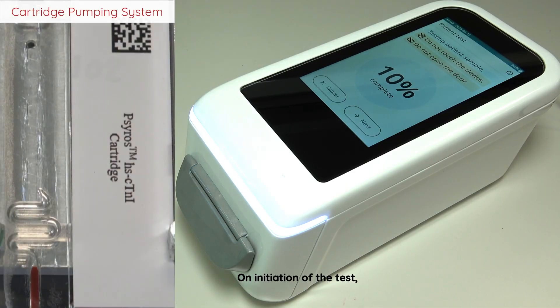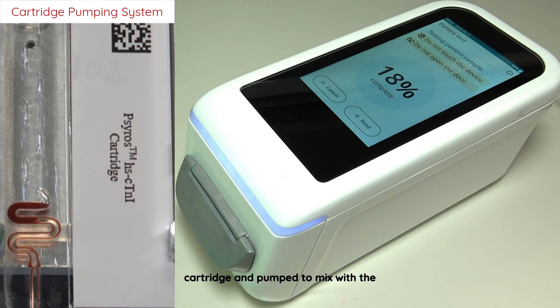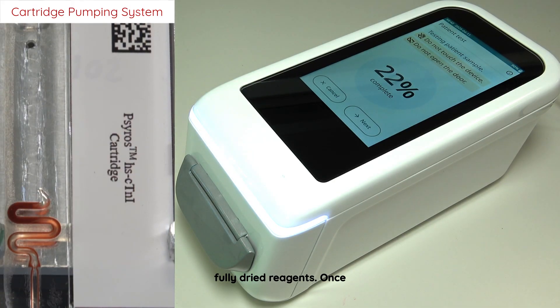On initiation of the test, the whole blood sample is drawn into the cartridge and pumped to mix with the fully dried reagents. Once resuspended, the instrument draws the sample mix into the measurement chambers.